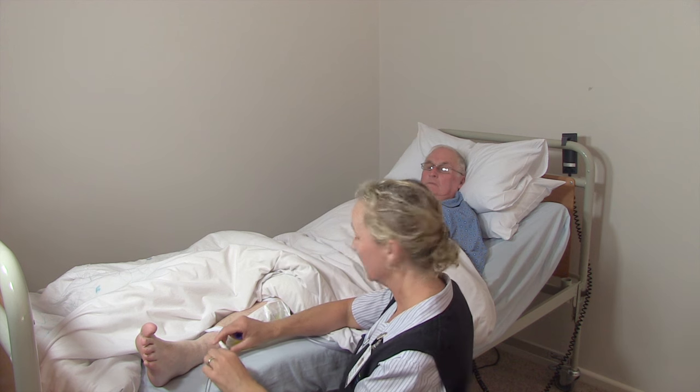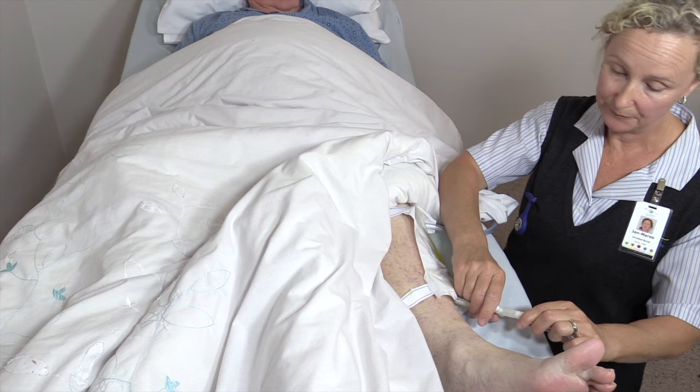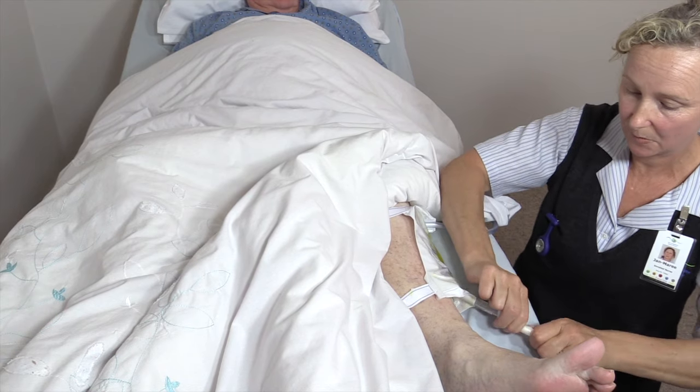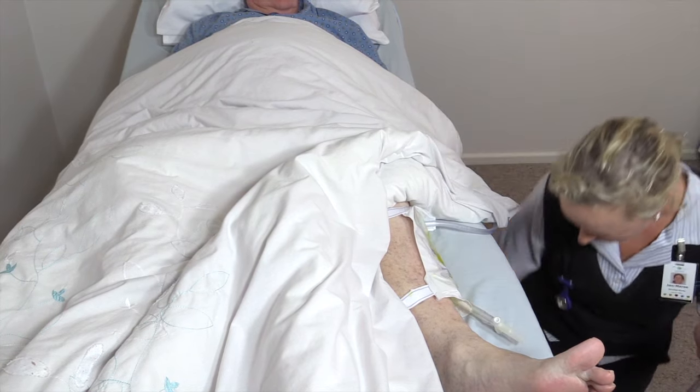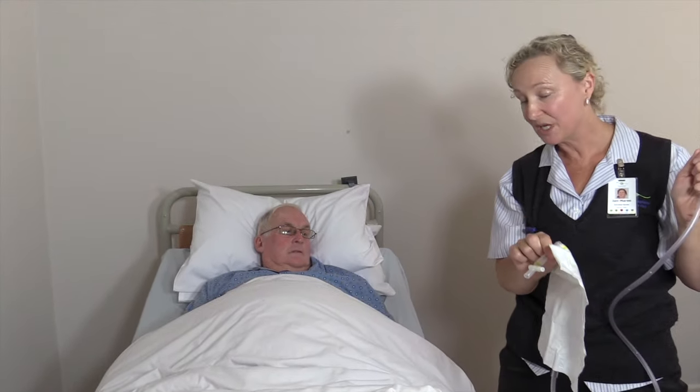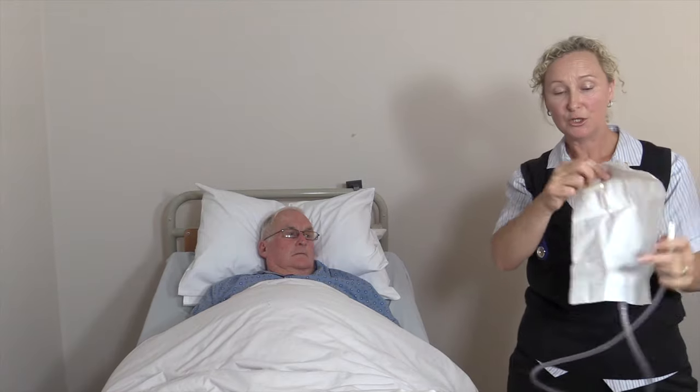In the morning, all you need to do is close the tap off and disconnect it. Always make sure that you've got the bottom tap closed when in use.